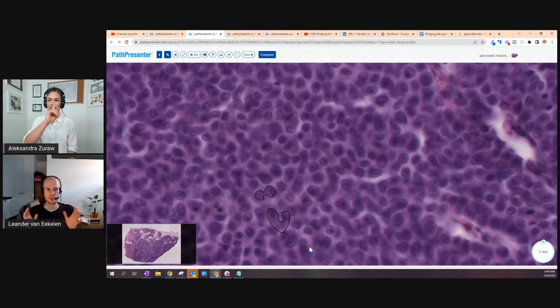Let me just insert one thing. What you call stuff, I also sometimes call regions, because you're going to have a region of nuclei, and the area of this should be correct. But if you want to count them, then that's not what you want. So if you want the best of both worlds, object detection and segmentation, we can do what you started talking about. So let's talk about that.